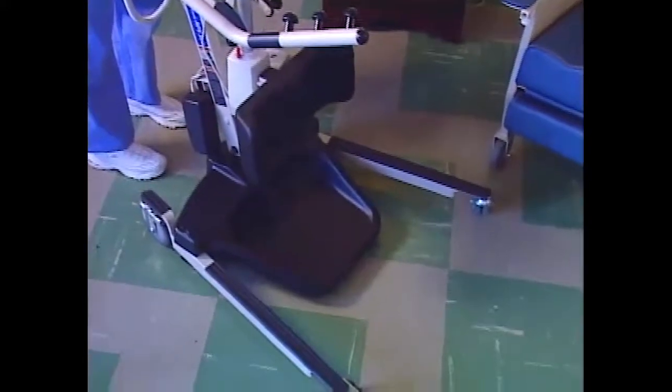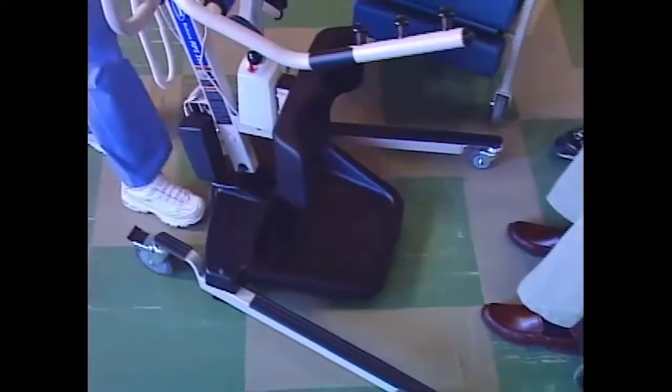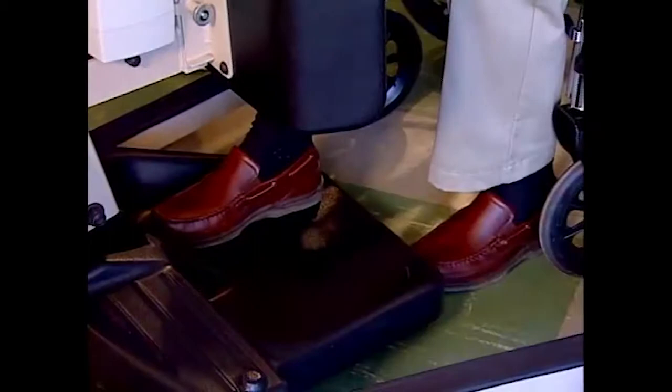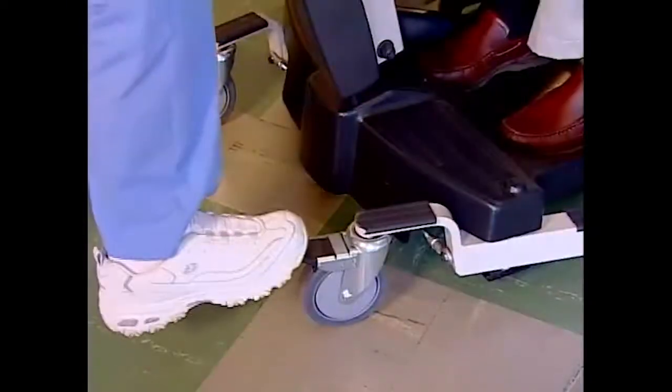Position the lift in front of the resident. Have the resident put their feet on the foot plate, and assist them if they need help. Move the lift in until the knee pad is resting against the resident's knees. Adjust the knee pad if necessary, then lock the casters.